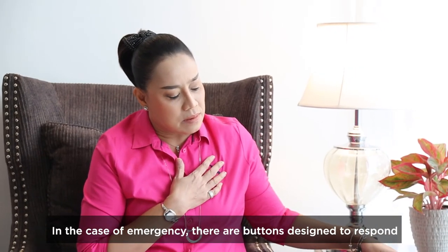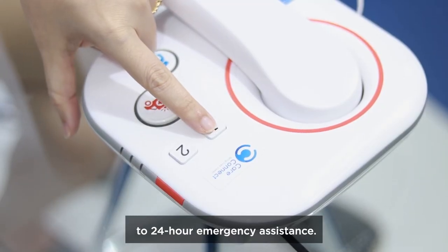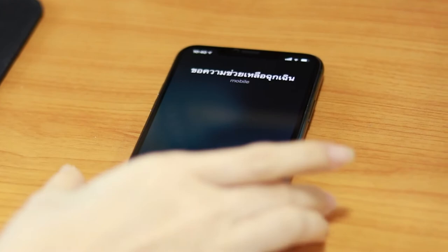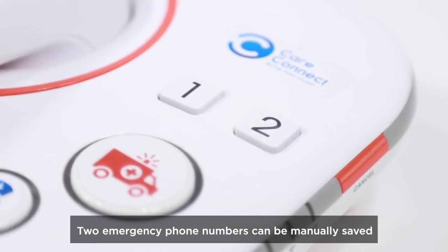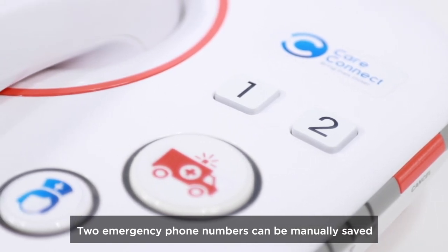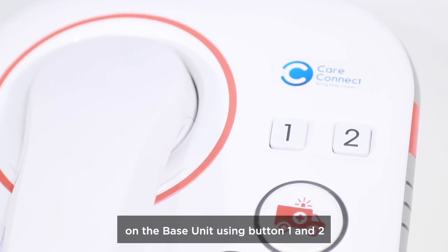In the case of emergency, there are buttons designed to respond to 24-hour emergency assistance. You can press these buttons to contact and seek help from your relatives or caregiver. Two emergency phone numbers can be manually saved on the base unit using button 1 and 2.